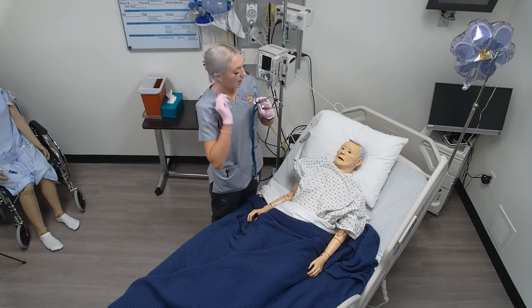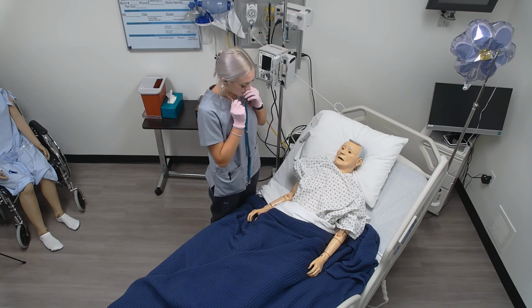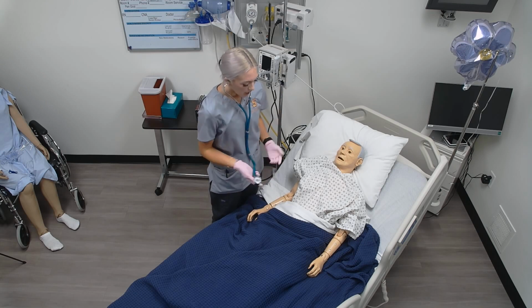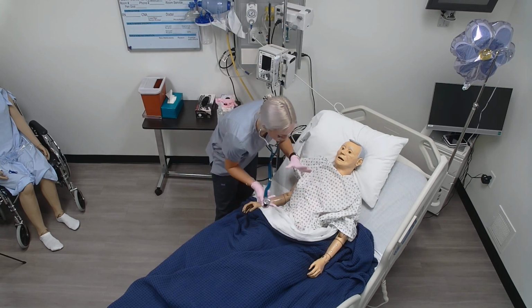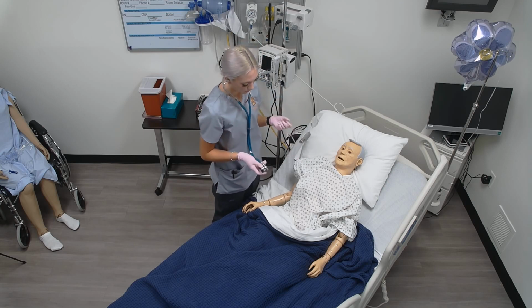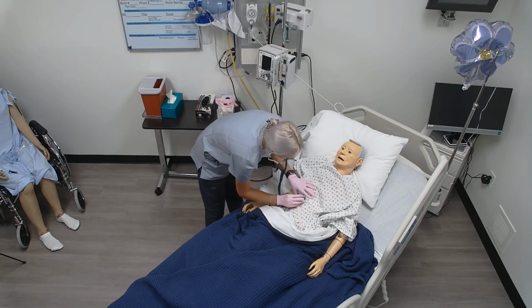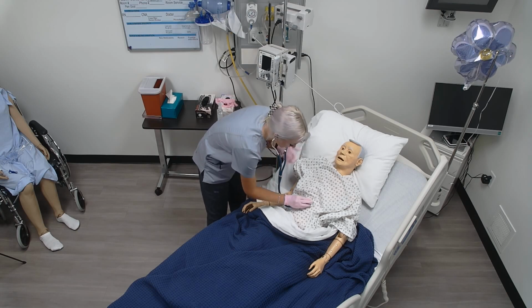So before I touch or palpate my patient, I'm going to take a listen. I'm going to listen in 9 regions just to make sure I don't miss anything. And while I'm listening, I'm also going to look out for bruit sounds. Okay, so I'm just listening for normal bowel sounds. Make sure that bowel sounds are present.